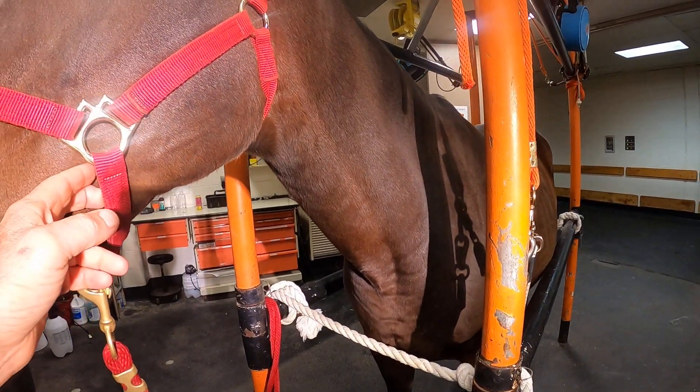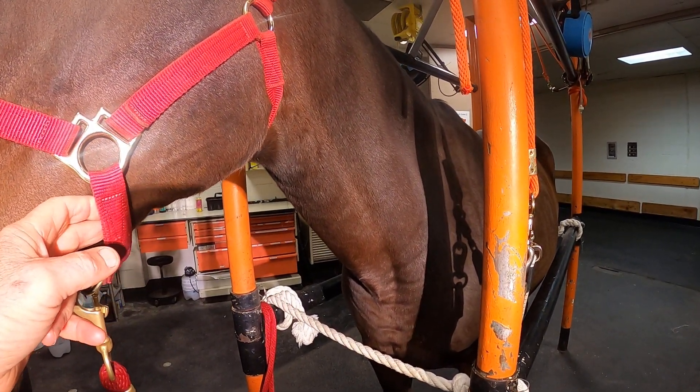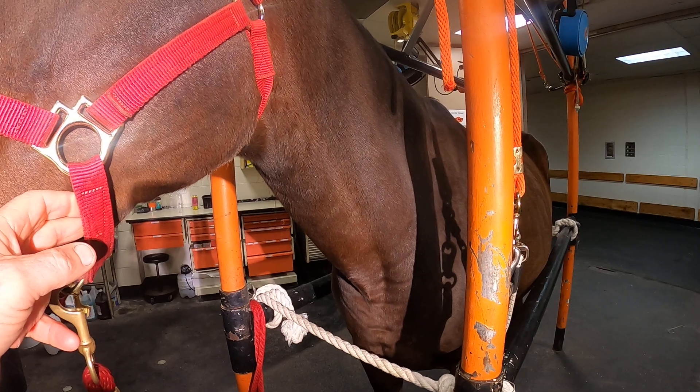Here we go. This video is going to demonstrate how to properly perform an IV injection.